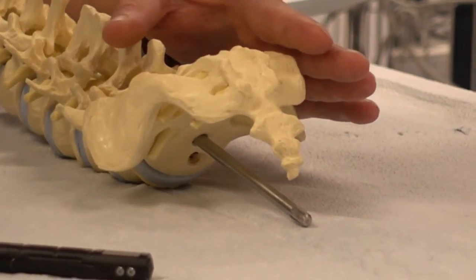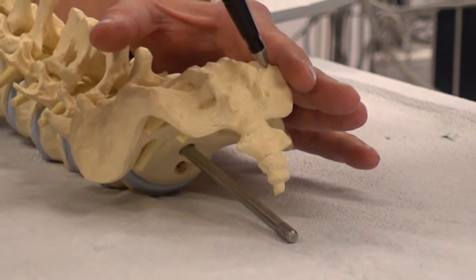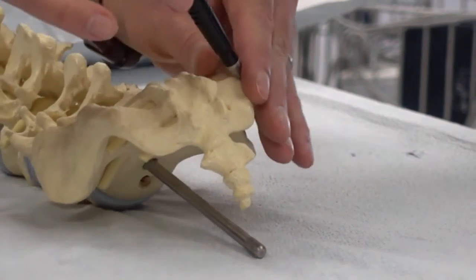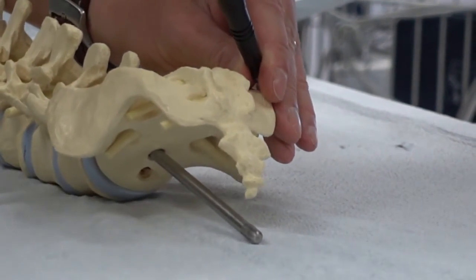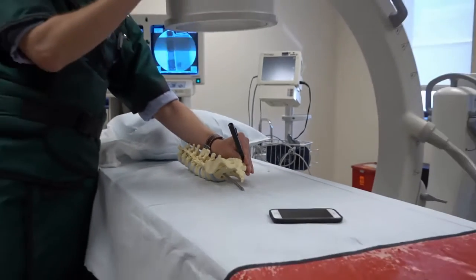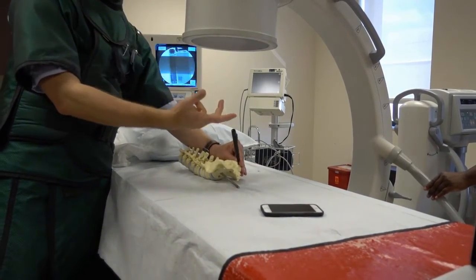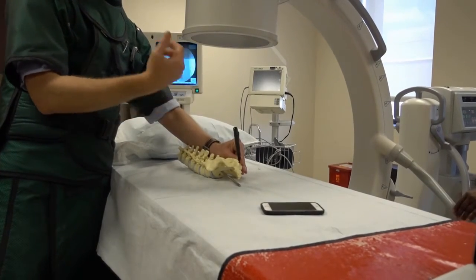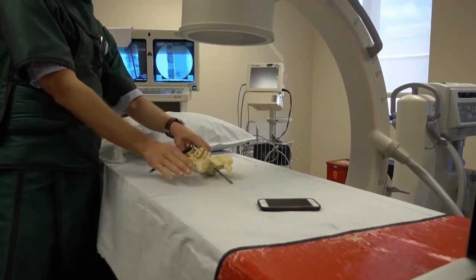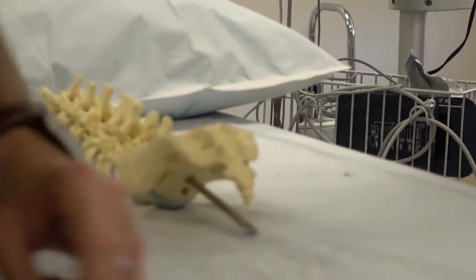We'll toe a little bit away, okay, and then I'll put the needle down right here, and then I'll walk it right into the joint, and then once I think I'm in the joint, I'll ask Michelle to just go a little more AP, just like that. Make sure that the needle's in the joint. Maybe you can go a little more. Make sure that the position doesn't change on the screen, and then I'll inject the contrast. If we're in the right spot, then we'll inject the medicine. And the same thing on this side. It's toed a little bit away from that actual side.